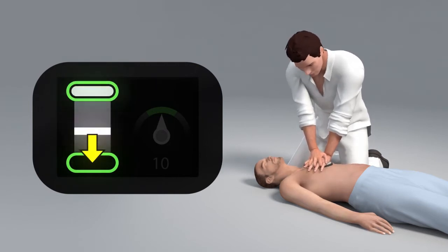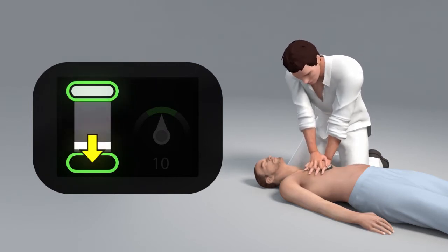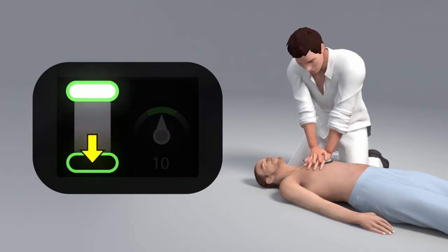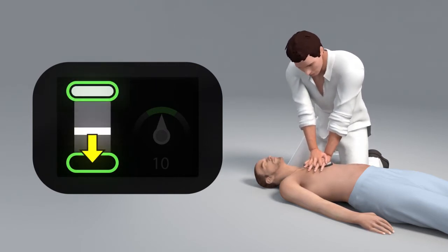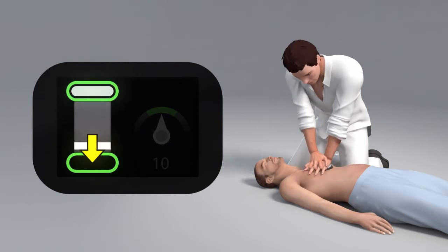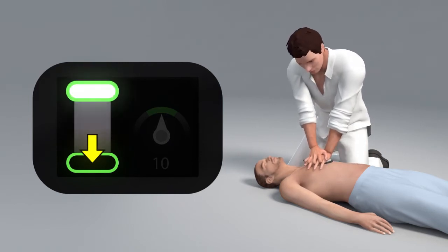If you continually do not reach the target, you will see a yellow arrow pointing to the depth target.